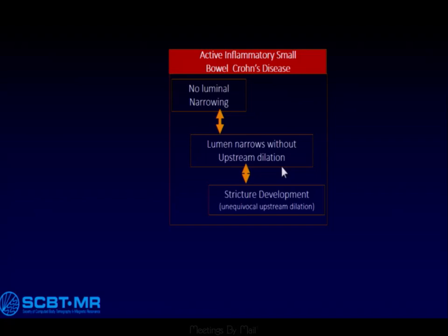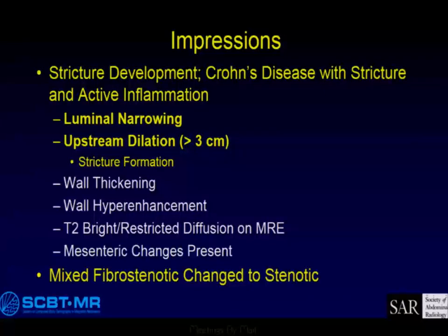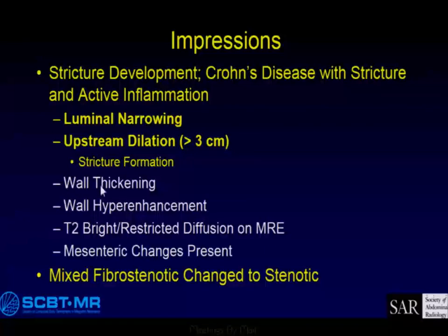What happens when things progress and we start developing a stricture? You've got luminal narrowing and then upstream dilation — stricture formation. If you look at pathology reports, their definition of a stricture is when the lumen is gone. We have defined it as: upstream dilation, wall thickening, wall hyperenhancement, T2 bright, restricted diffusion. Everything present on active disease is going to be there with stricture development and active Crohn's disease.